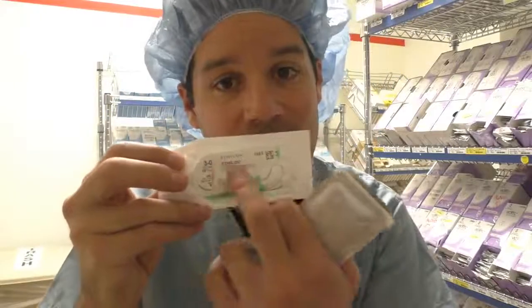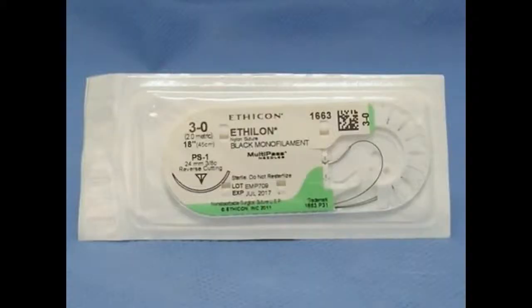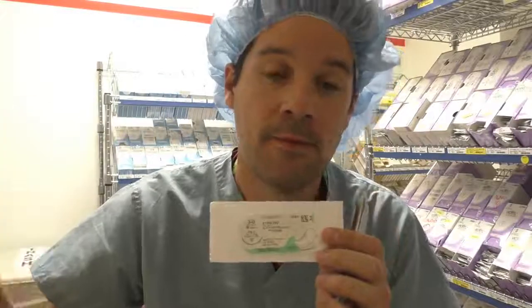The second monofilament I have for you is the nylon, also known as the Ethilon suture. This monofilament suture, non-absorbable, is also black in color, just like silk, but the packaging is green. What's the big difference between the silk and the nylon? Think about it. Remember, silk is multifilament, nylon is monofilament.